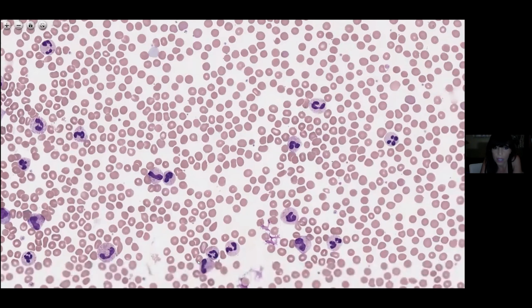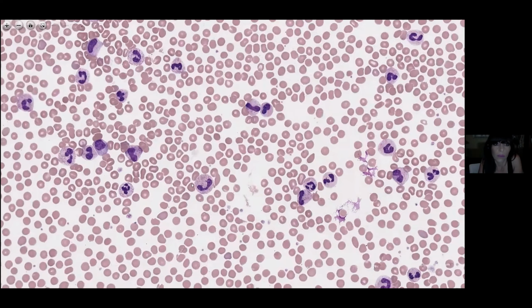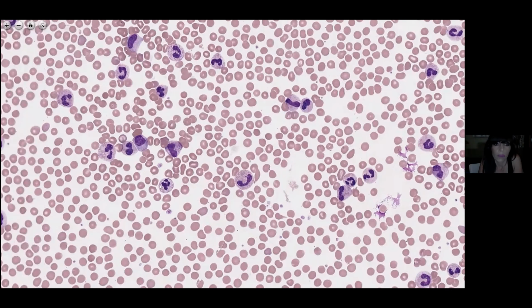We report them together, the two cells. I'm not sure what other people do. It'd be interesting to see people's comments in the comments section.